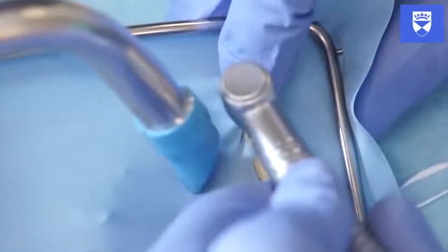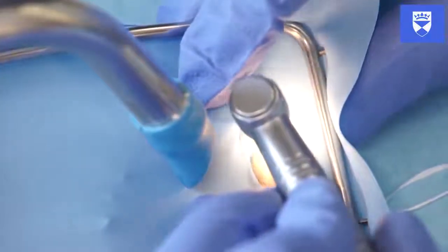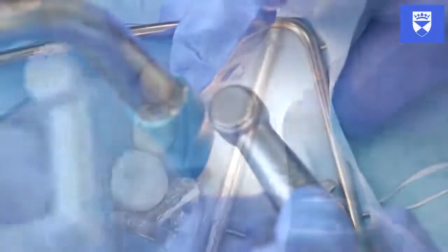Gain access to the caries using the diamond fissure burr within the high-speed handpiece. Ensure that you establish clean margins circumscribing the cavity.